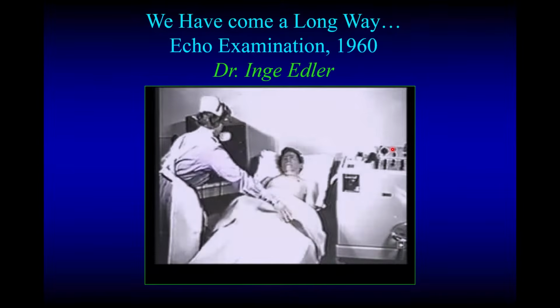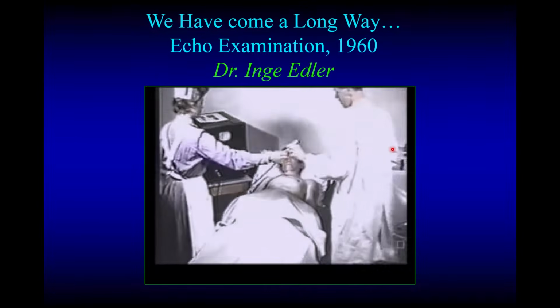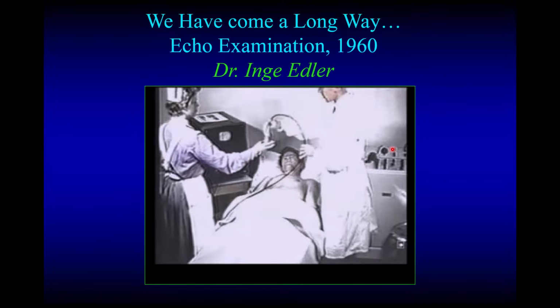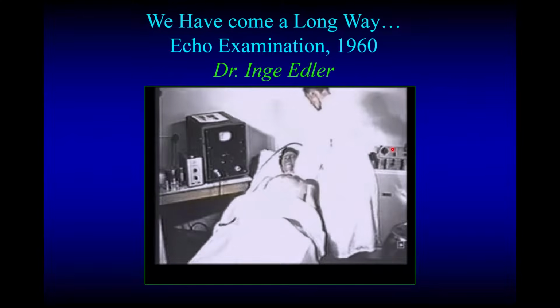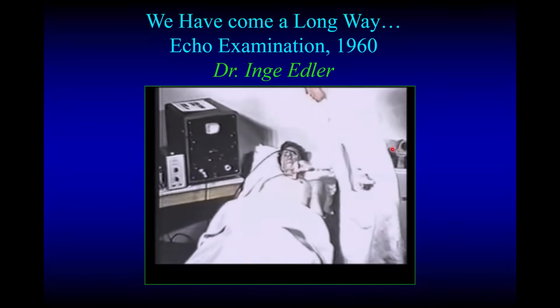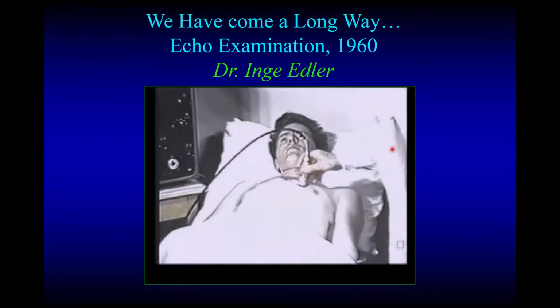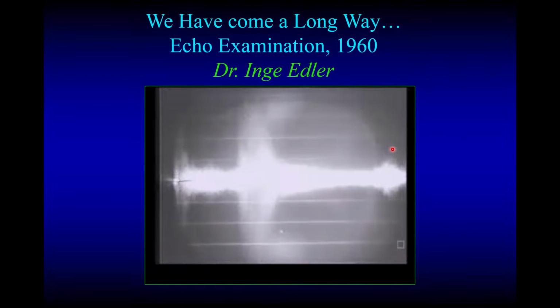For our sonographers, this is the dress code at that time, and you may want to revert to it. It really depends what you wanted to do. This is Dr. Inge Edler himself, dipping the ultrasound in a little gel, and putting it on the chest, and you're going to see the beautiful A mode of ultrasound. And actually, that's what started the ultrasound field.